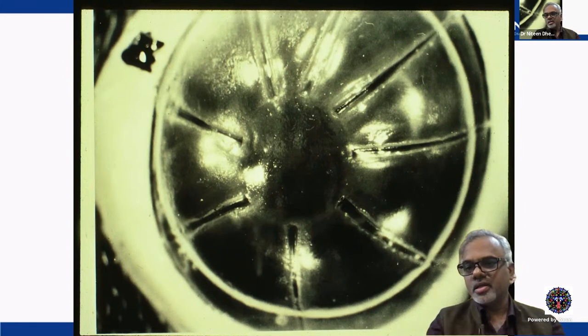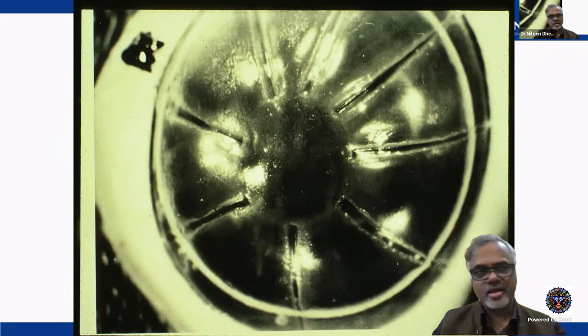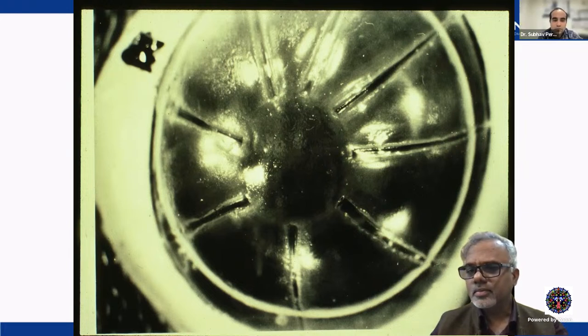That is horizontally. You are not puncturing the cornea, but you want to take a slice of the cornea, maybe 10 microns, 20 microns, or maybe a 50-micron-thick flap. You take the flap of the cornea. So, is the cornea opaque? No, it's a transparent structure.